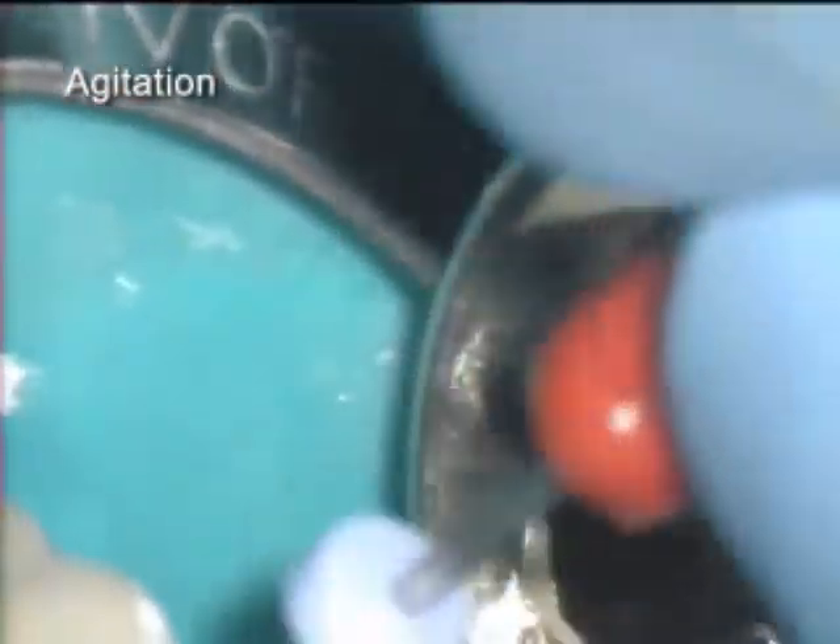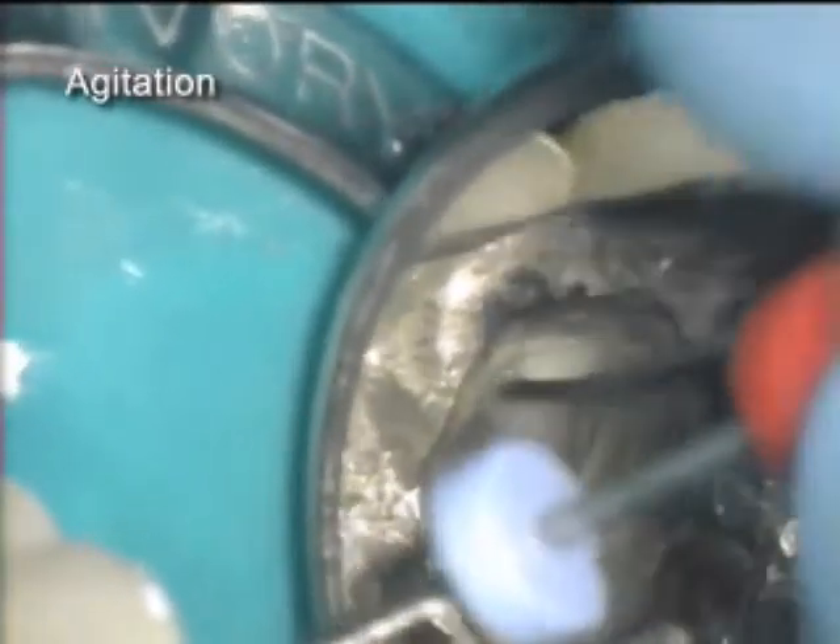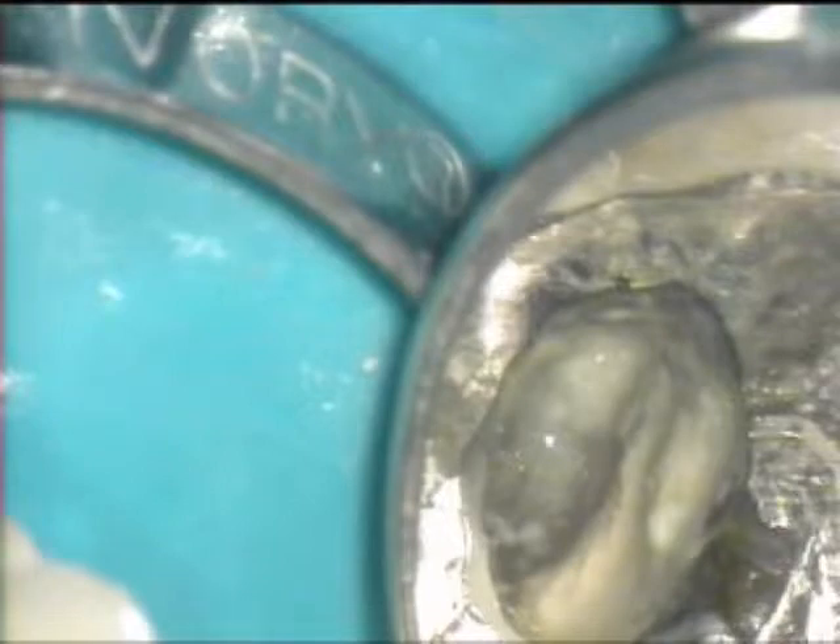A hand file is used to agitate the BioPure MTAD solution in the canal space. More material can be seen being lifted into the pulp chamber. This freeze frame shows material that has surfaced from the canal spaces.